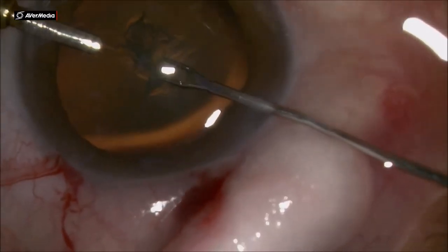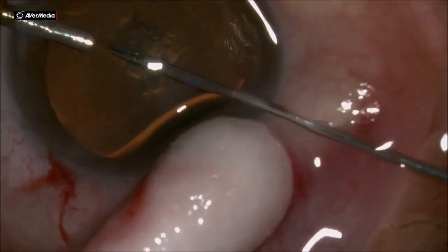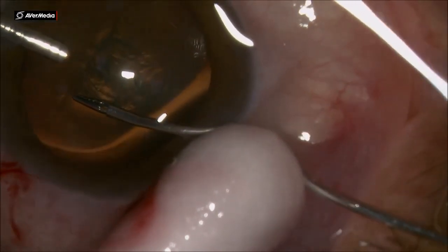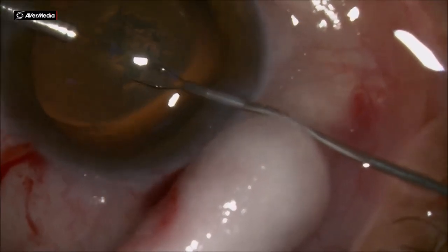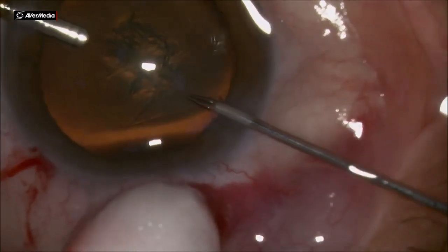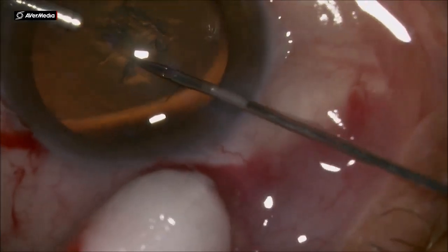We have a closed angle glaucoma in early stages of the disease, and the patient opted for multifocal IOL, and we're going to place a trifocal IOL from Zeiss. The cataract is pretty soft. It's pretty much an aspiration that is done. I'm using in this case the Quatera phaco machine from Zeiss.